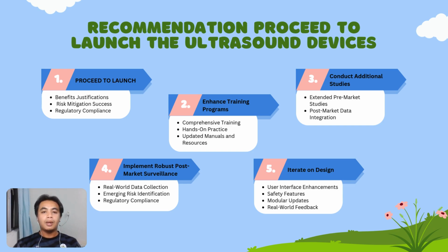The second, enhanced training programs address operator-related risks by developing and implementing targeted training programs. Simulation-based training: hands-on scenario-based training to prepare operators for real-world challenges. Use manuals and tutorials: detailed guides and video tutorials for quick learning and troubleshooting. Refresher courses: periodic training sessions to ensure operators remain proficient with evolving features or updates.